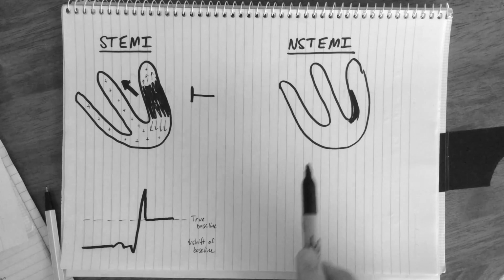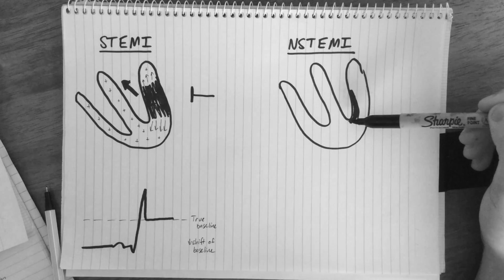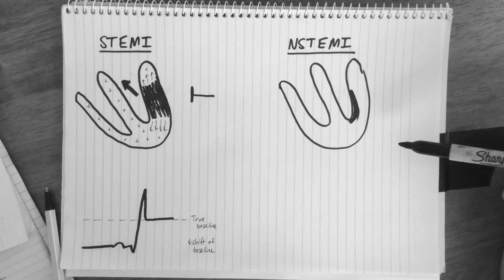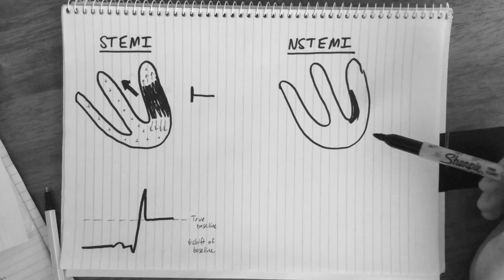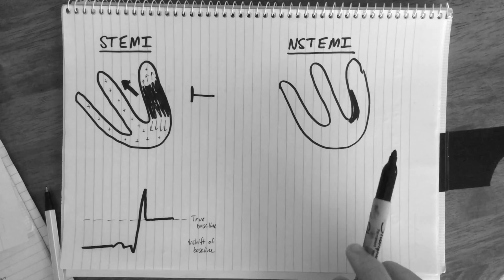It is important to note that similar ECG changes occur in NSTEMIs and unstable angina, and the way we differentiate between the two is by testing for our cardiac biomarkers, e.g. troponin and CKMB. These biomarkers will be elevated if the tissue has infarcted, as in the case of an NSTEMI. But if the tissue has only undergone ischemia, we will not see biomarkers, and we can therefore assume it is unstable angina.